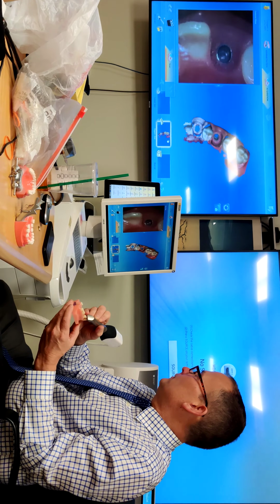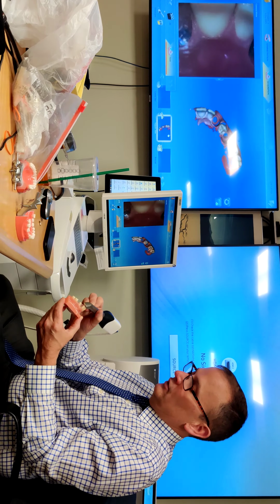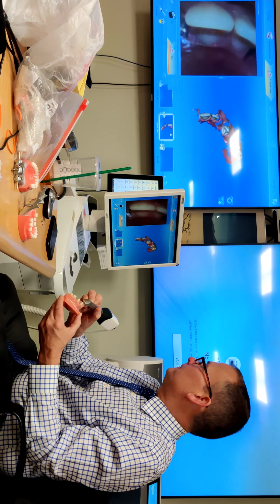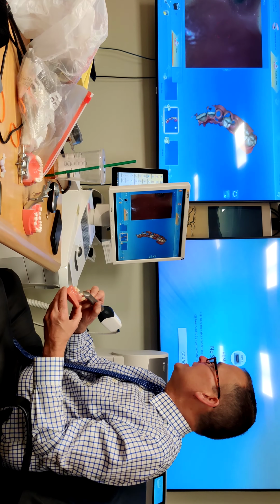It's still scanning. Now we can drop down. We can change the color to hard. It was hard. Okay, do you see?